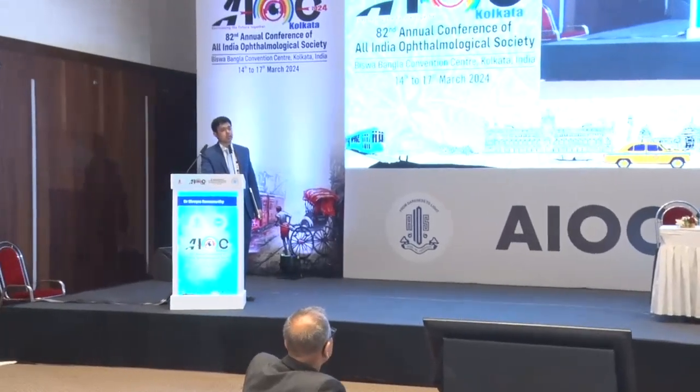The thing is that the 2 don't match, the 700 and this, and the explanation given was that the tear film plays a role, and the Anterion kind of does away with the tear film because it's OCT based as compared to the 700. The 700's anterior Ks are not measured from the OCT but from the same number of points used in the 500. The keratometric measurement is still telecentric, whereas the TK value comes from the posterior toric fit, which is SSOCT based. The Anterion does both the anterior and the posterior measurements from OCT, so they are sometimes different.